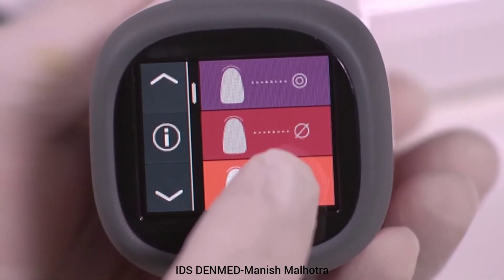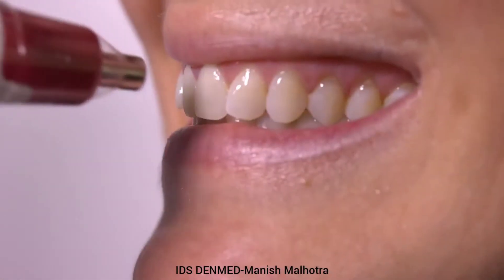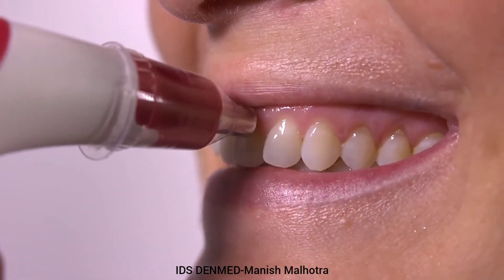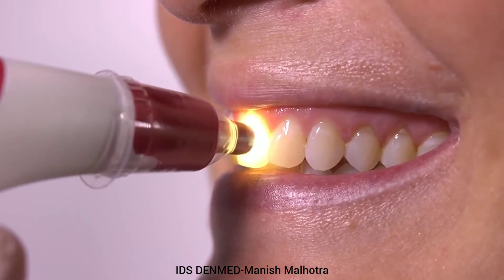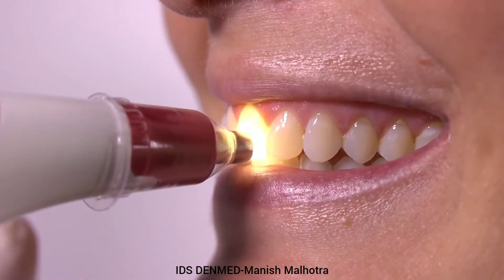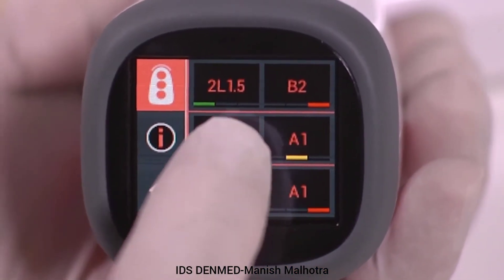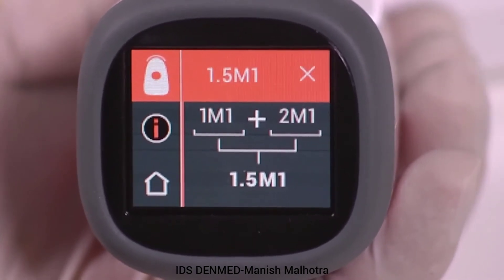Go back to the natural tooth measurement screen and select the tooth area measurement tab at the bottom of the screen. Three separate measurements can be taken to display cervical, middle, and incisal tooth shades on one screen. Additional Vita 3D Master and/or Vita classical shade information can be displayed by selecting the shade color bar.